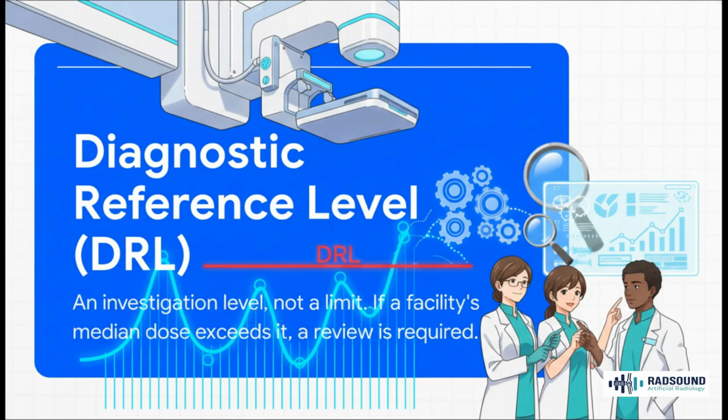A key tool in that safety net is something called the Diagnostic Reference Level, or DRL. Now listen, it is crucial to understand this. A DRL is not a legal dose limit. It's not one line you can never cross. Think of it as an alarm bell. It's an investigation level. If a clinic finds that its average dose for a standard breast is consistently creeping above that DRL, it automatically triggers a review to figure out why and fix it. It's a brilliant tool for continuous quality improvement.